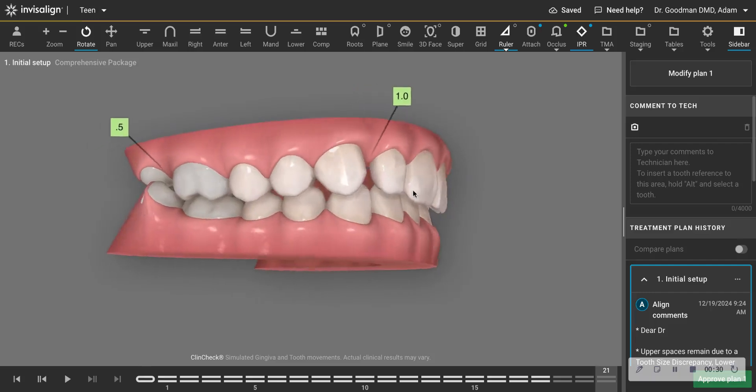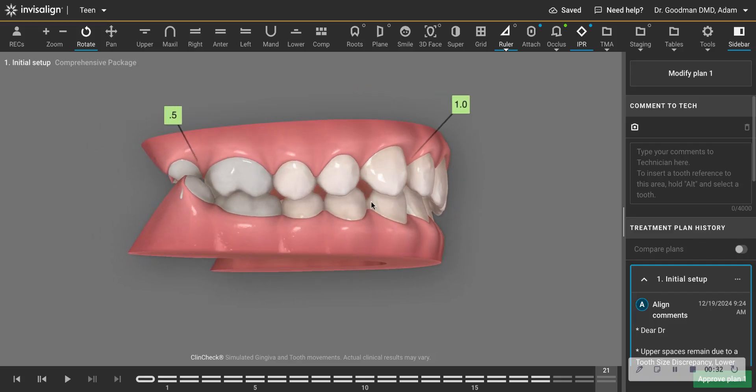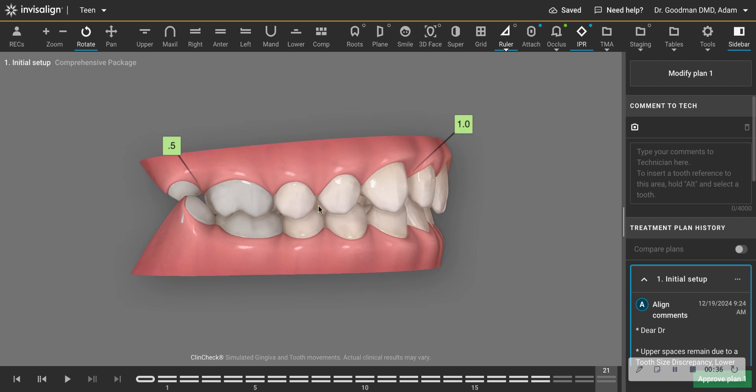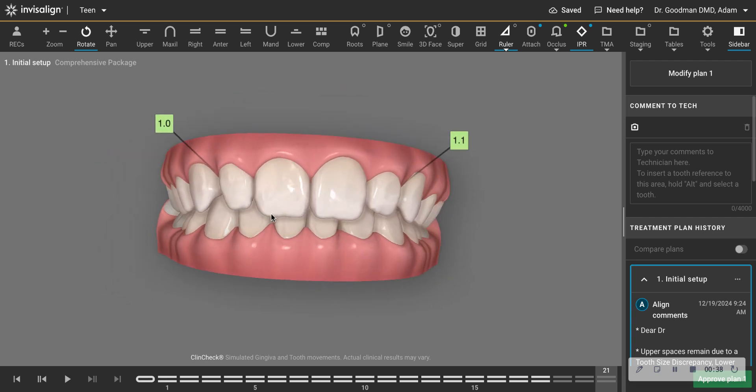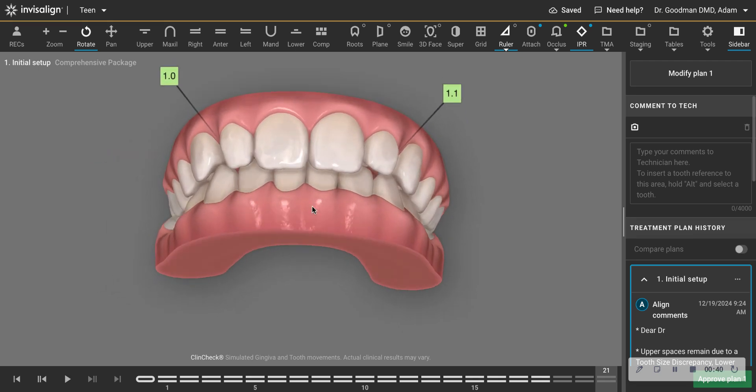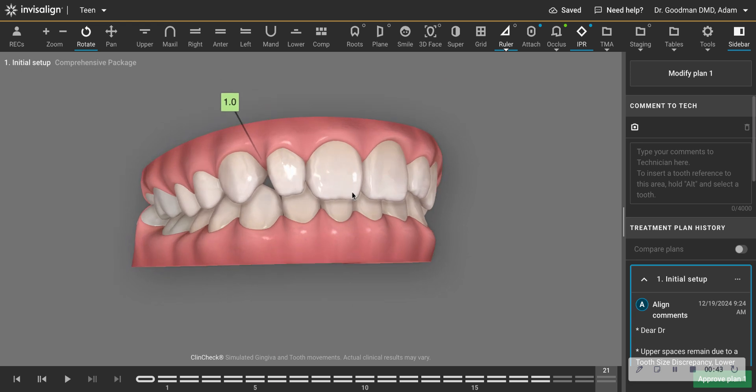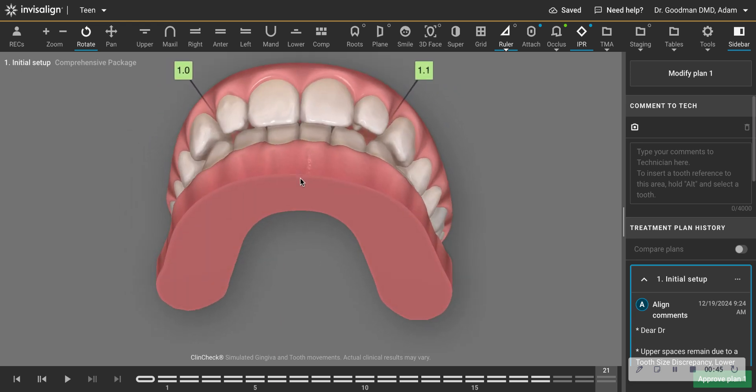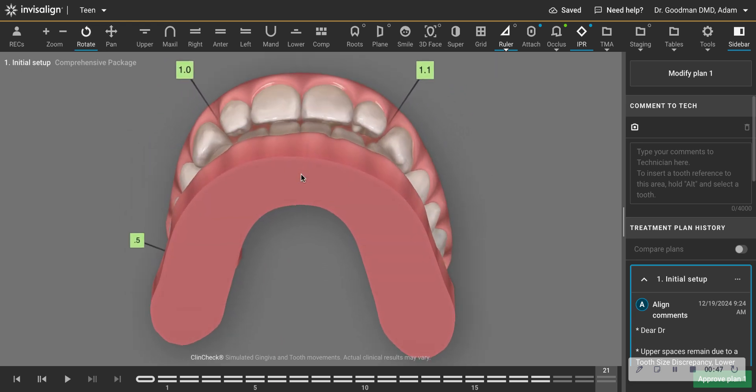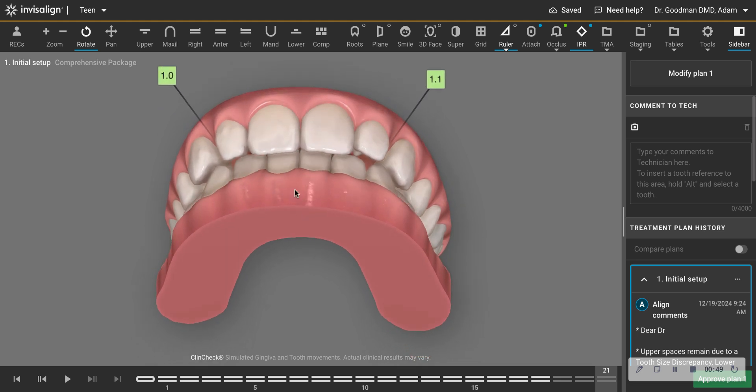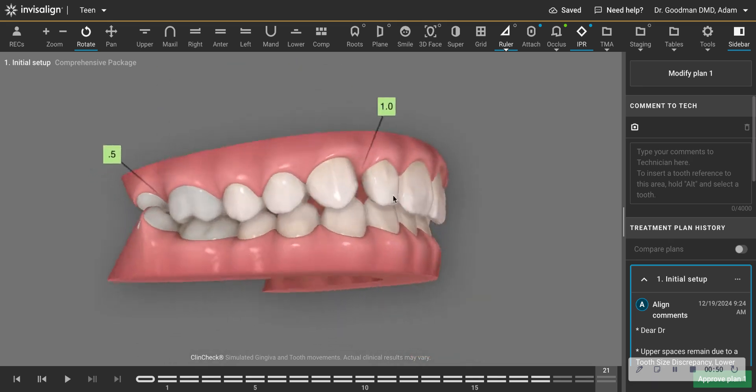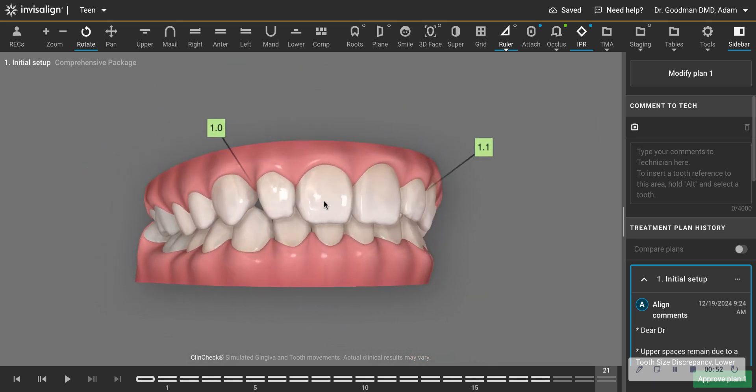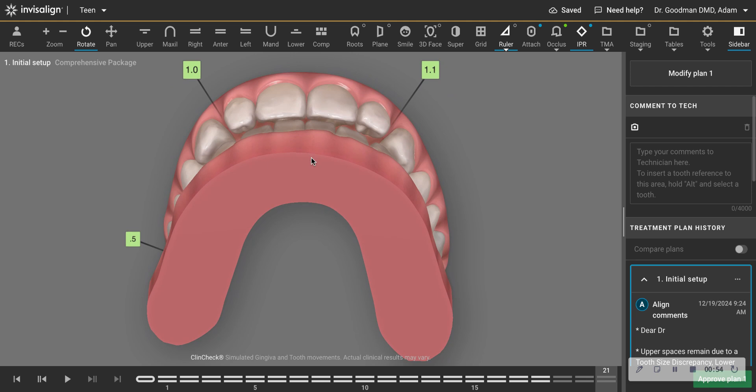you'll see that there is no mandibular jump planned here and I can add that. There's a Bolton discrepancy of the upper arch because you can see the lateral incisors. So I did leave some space around that and I have to advance the mandible to get into a solid Class I on the right side. But as you see, there's not a lot of overjet.